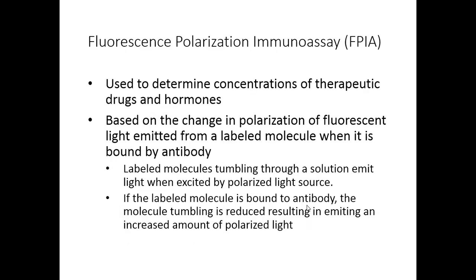Because this is competitive, we're looking at this labeled antigen competing with unlabeled patient antigen to bind to an antibody. So if I have more patient antigen bound to the reagent antibody, and I'm washing away the labeled molecule, there's less of the labeled molecule bound to antibody, so we have less polarized light.